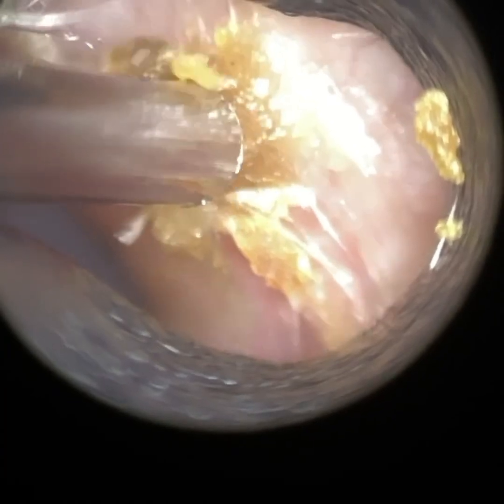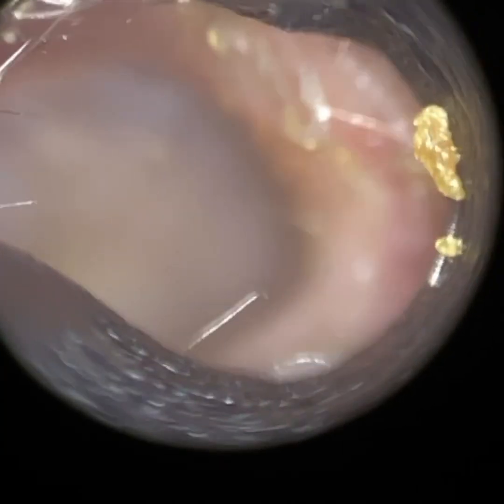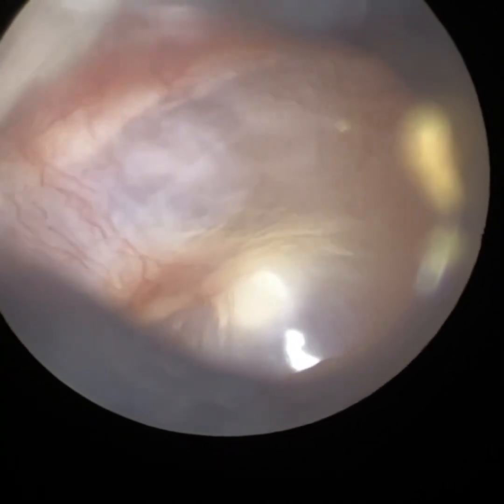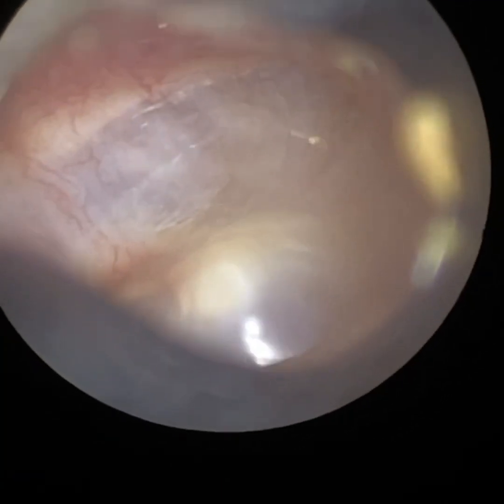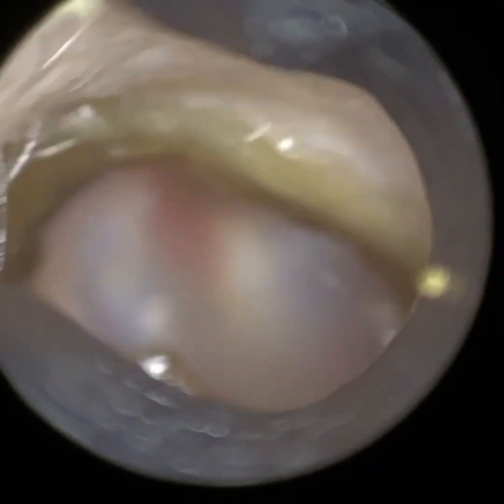In some cases you'd probably leave this, but for this particular client, for the reasons I just explained, I want to remove as much debris as possible, but as safely as possible. And with the endoscope it's always been really great because I've got that fine motor control, that precision. So it was quite interesting for me to perform it today using the Waxscope.